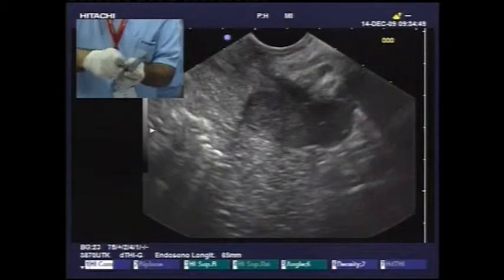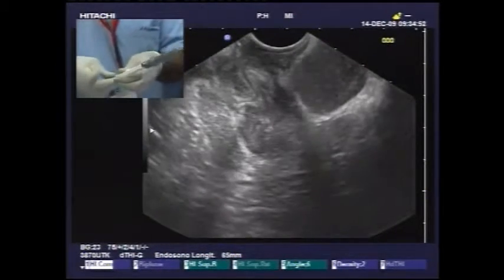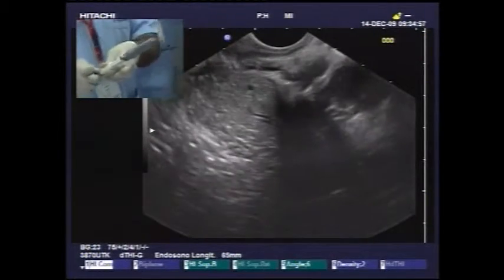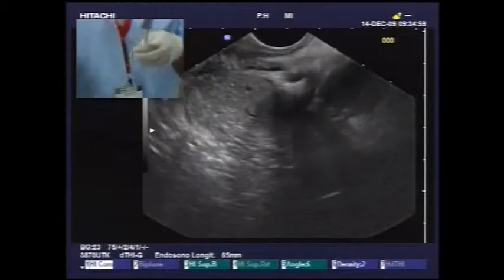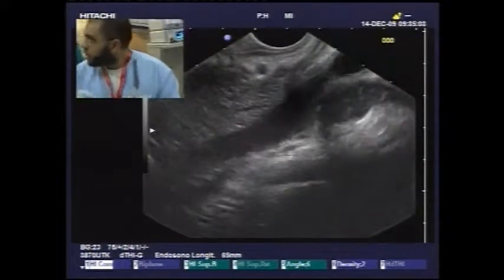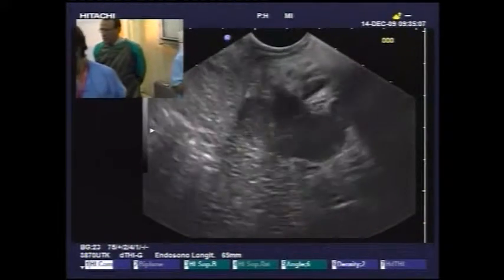Hands up for those who believe that we should be stenting the pancreatic duct alone. Hands up for those who think nasocystic is the best. We should place a nasocystic drain through the main ampulla. Yeah. More and more pus here.